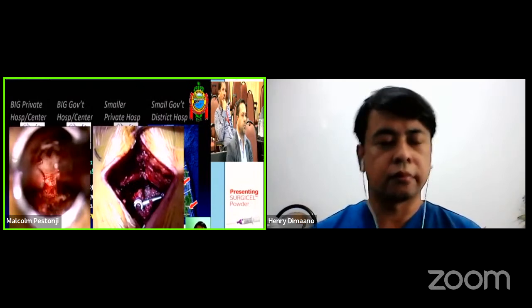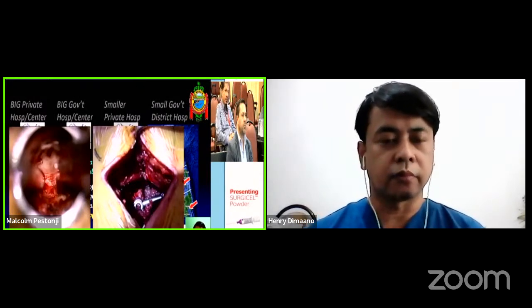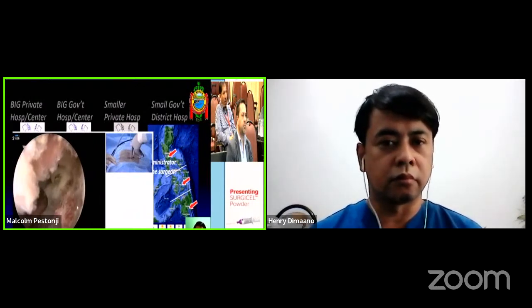And so we're so used to seeing our target with our eyes, and we like to directly see where we're going. And it's so different from this view, the endoscopic view, wherein you cannot directly see what you're manipulating and that you're relying primarily on the endoscope camera view in order to do your thing.